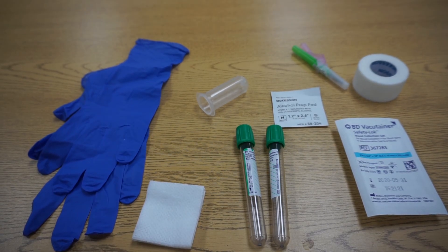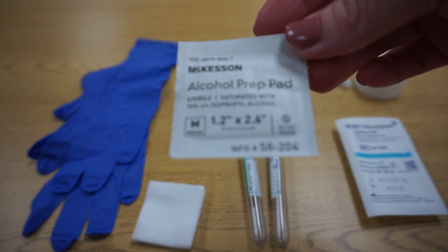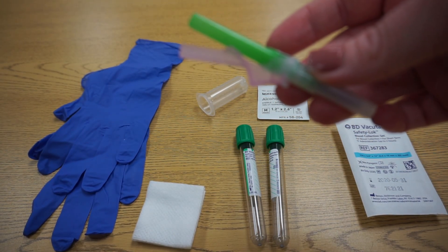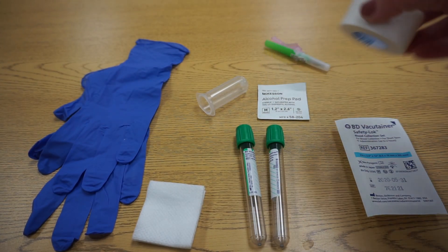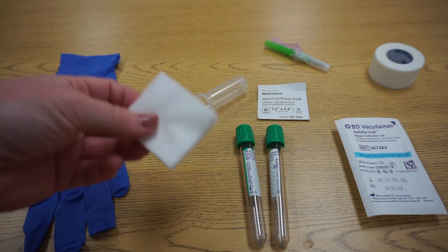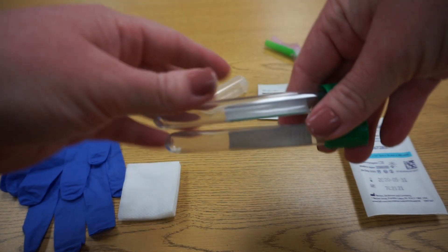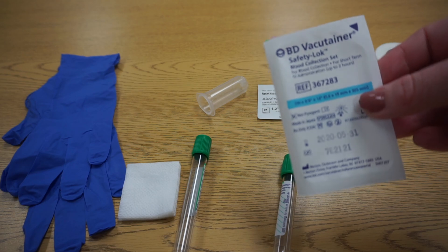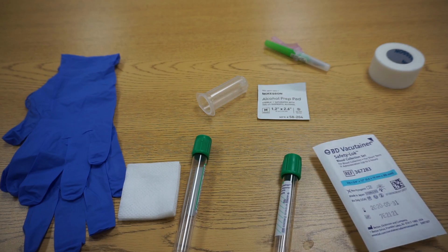Today I'm going to show you the supplies you're going to need for a blood draw. First we're going to start off with the alcohol prep pads — you want it to be 70% isopropyl alcohol. Next we're going to use a straight needle; make sure that you don't expose the needle on the end. Then you're going to need some tape, gloves, and gauze to stop the bleeding and hold pressure. Vacutainer tubes — this will depend on the test. And lastly, you can also use a butterfly needle, which is also called a wing set infusion. And these are going to be the supplies that you'll need.